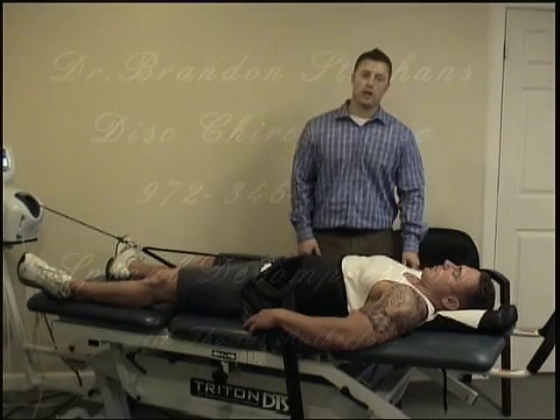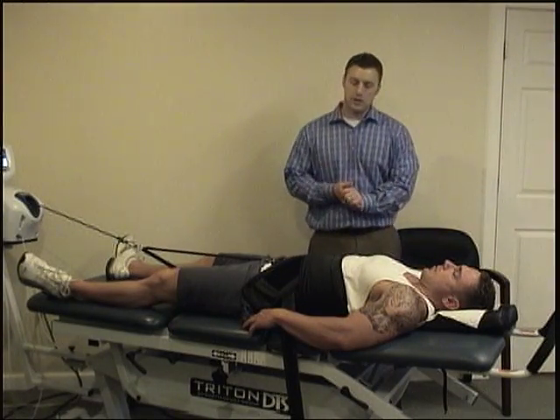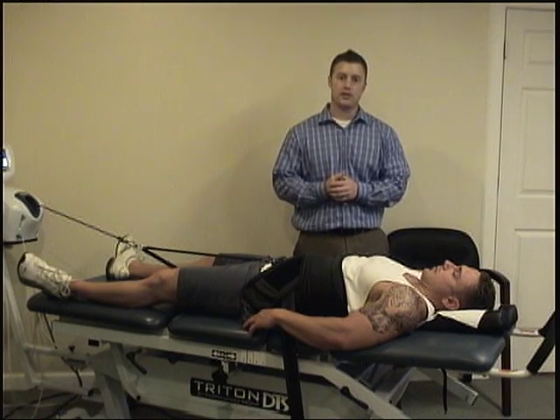All right, we got Tom here on the spinal decompression table. Tom, being the bodybuilder that he is, putting a lot of weight, doing the squats, the deadlifts — all that puts a lot of stress on the disc and the low back.